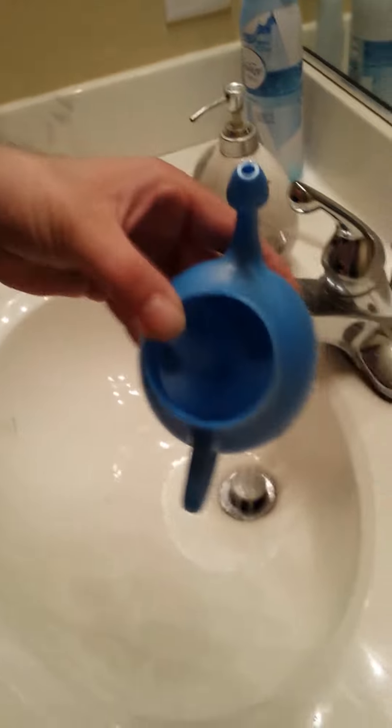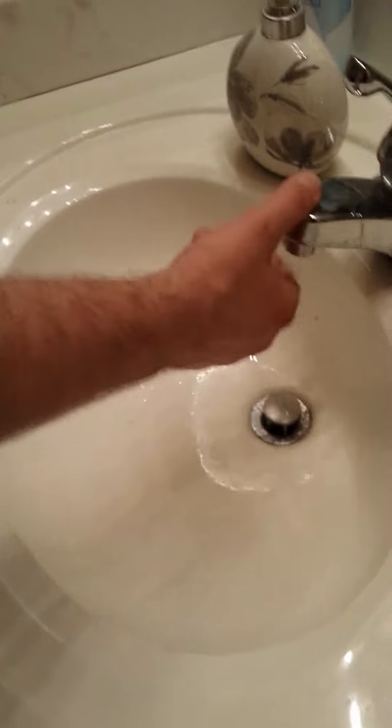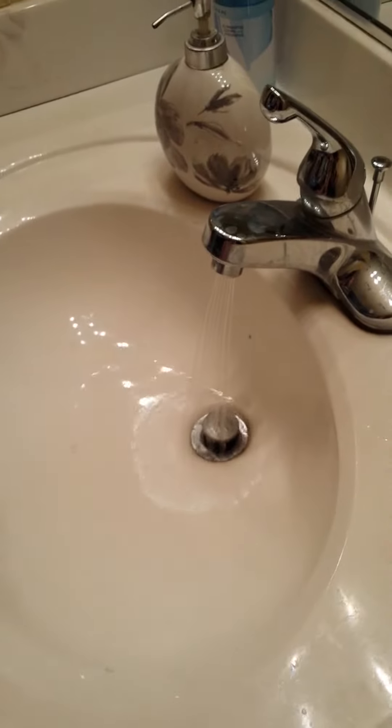Okay Nick, you asked for it — the neti pot challenge. First thing you do: put a little saline solution that comes with the neti pot into the neti pot. Lukewarm water — very important.